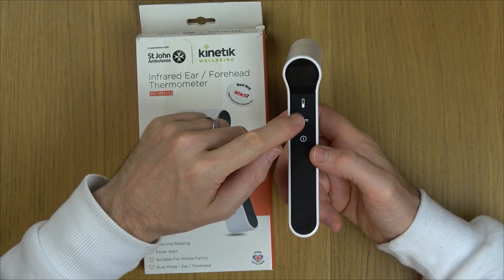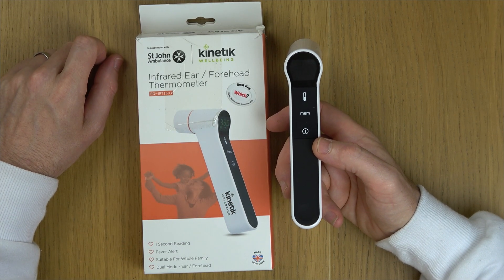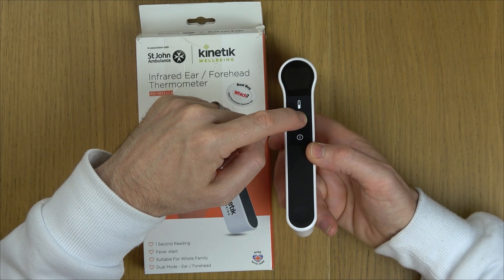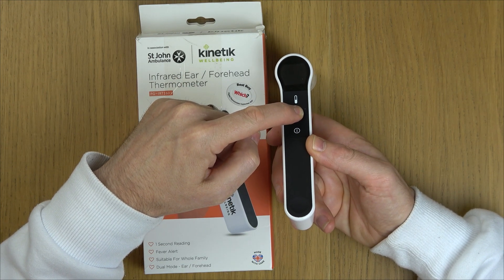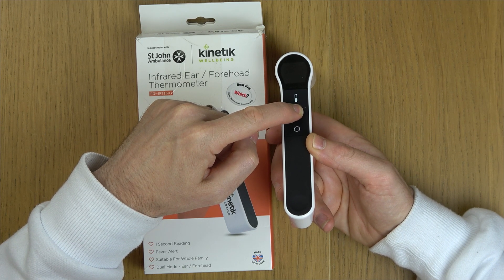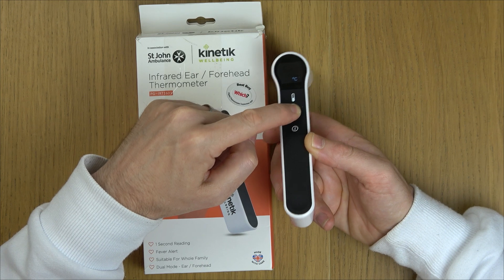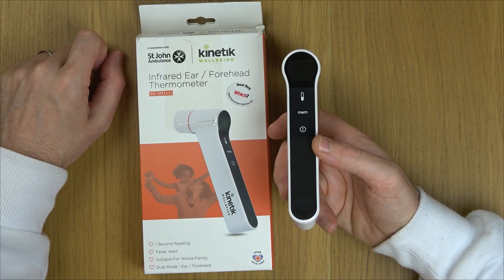We need to hold down the memory button for about six seconds and then it will allow you to change between them. So I'm going to hold it down now — keep holding it, still holding it — and eventually it will flash up with Celsius there.